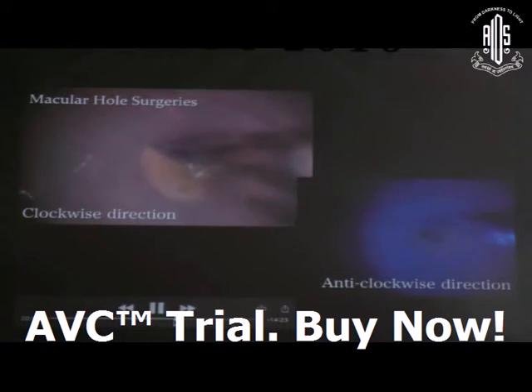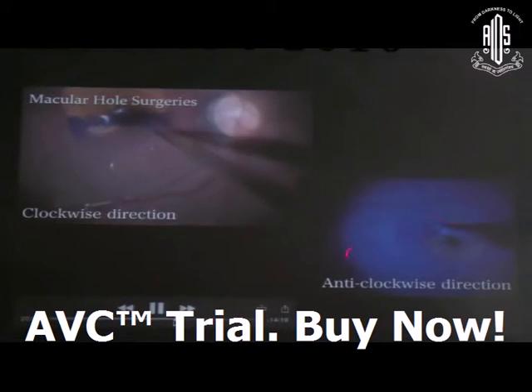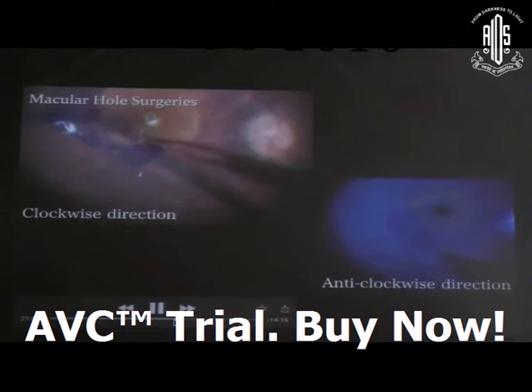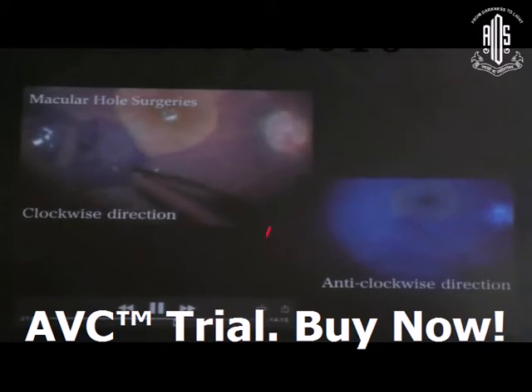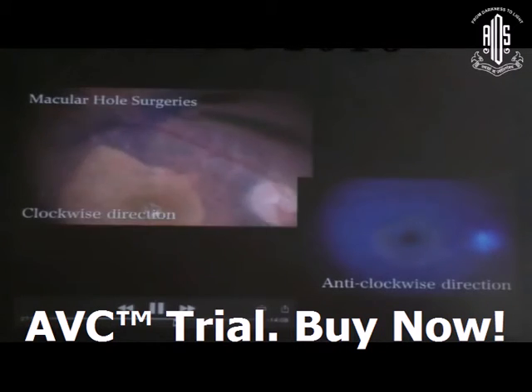I am creating the flap from the margin of the macular hole. You can proceed in a clockwise or anti-clockwise direction — peel in an onion-peel technique, enlarging the ILM peel area to get a better closure pattern in the post-op period.